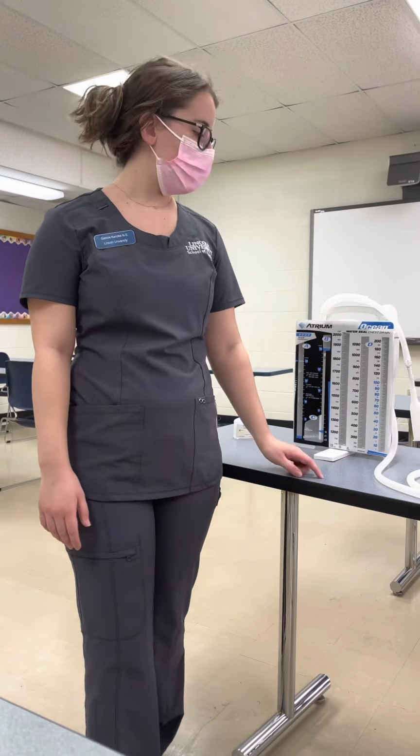I'm Gabby Karaka, an A semester nursing student. Today's date is February 9th, and I will be explaining a chest tube.